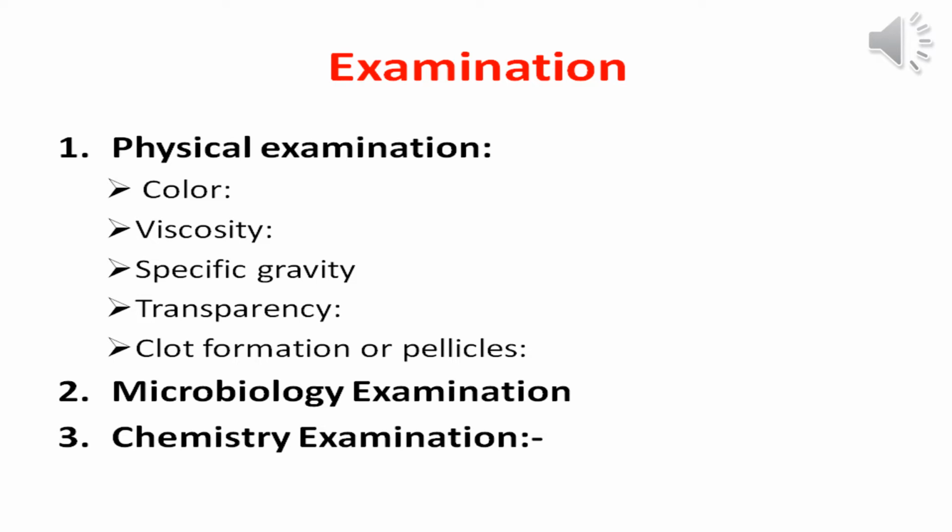Also we can do wet mount preparation. Wet mount preparation by taking the CSF sample in the center of a clean slide, then cover it with a cover slip, and you can examine it under the microscope under 40x to see the amoeba.